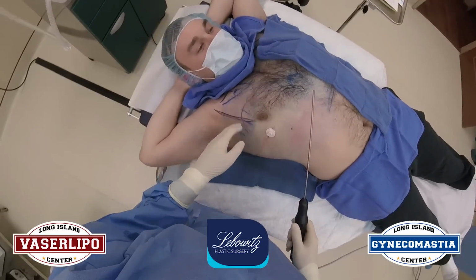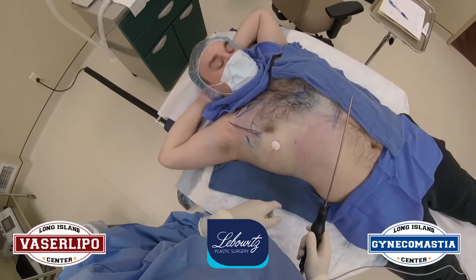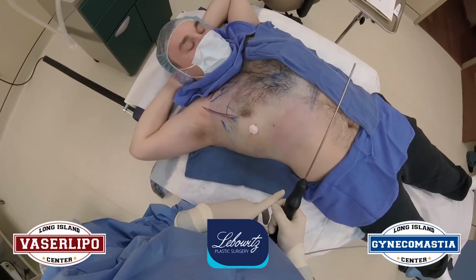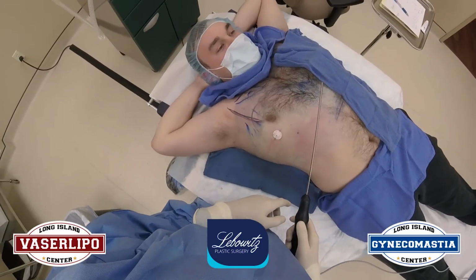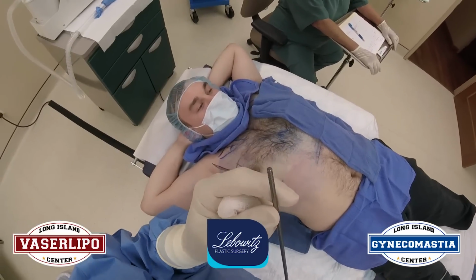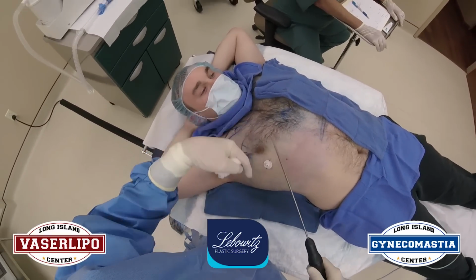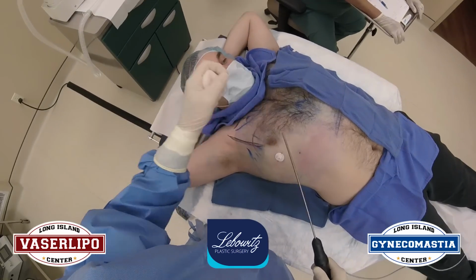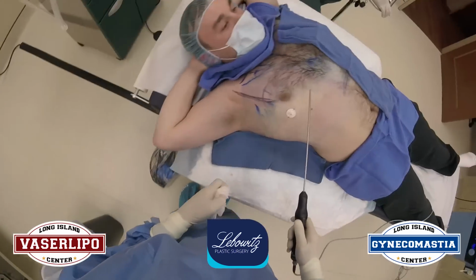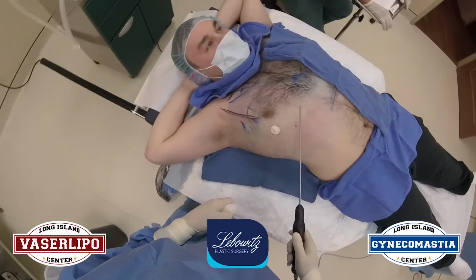So here we are back in the operating room. I've already numbed them up, and you can appreciate the whiteness, the vasoconstriction, because the tumescence that I use has epinephrine and lidocaine in it, and a little bicarb to stop the stinging by modulating the pH. And I'm using the 5-ring probe, which gives 75% of the energy around it and only 25% at the top, because I want to melt and contour for his high definition physique.